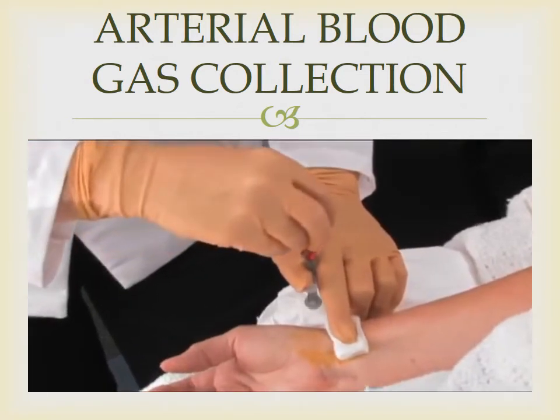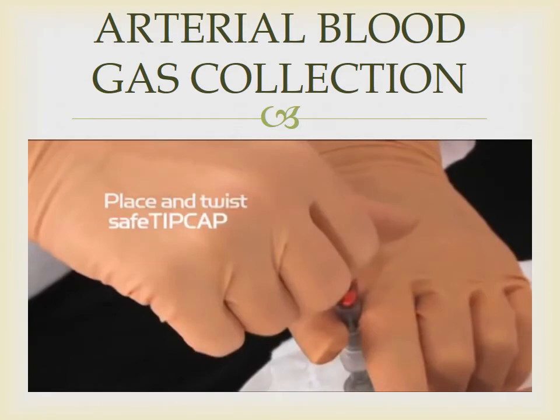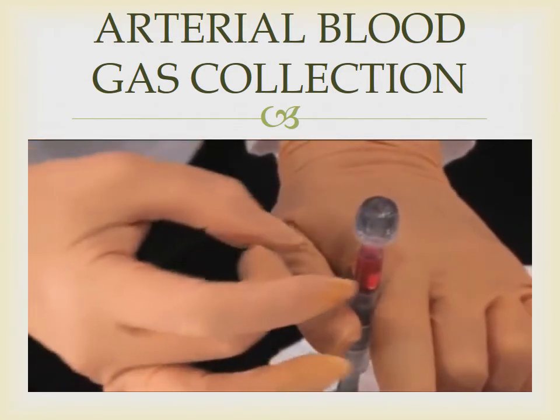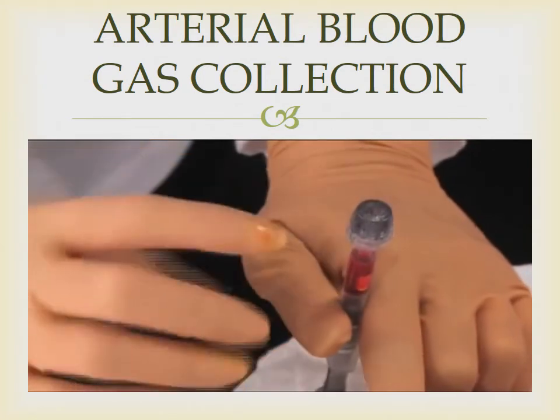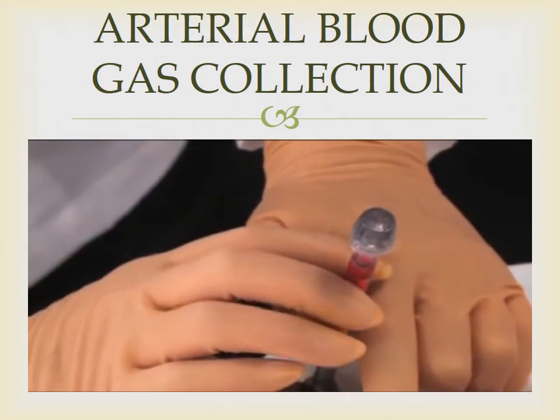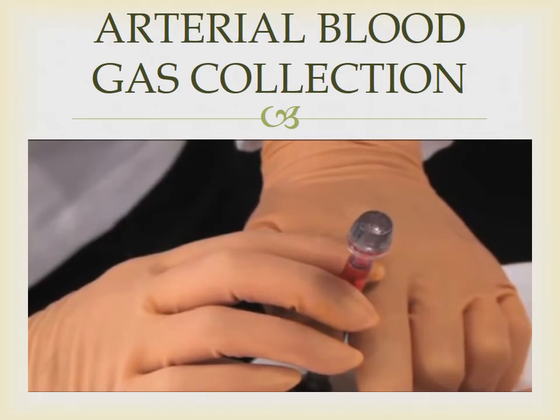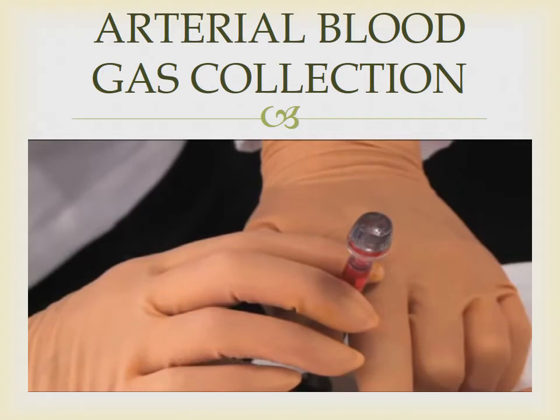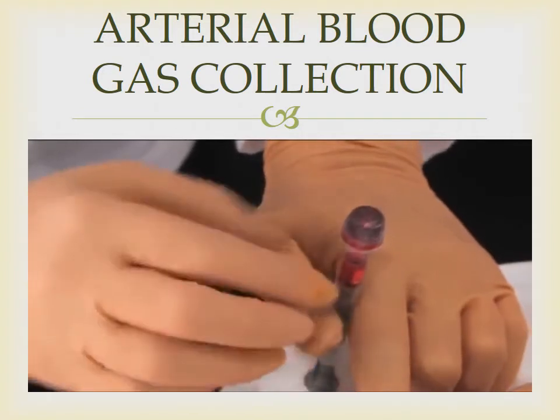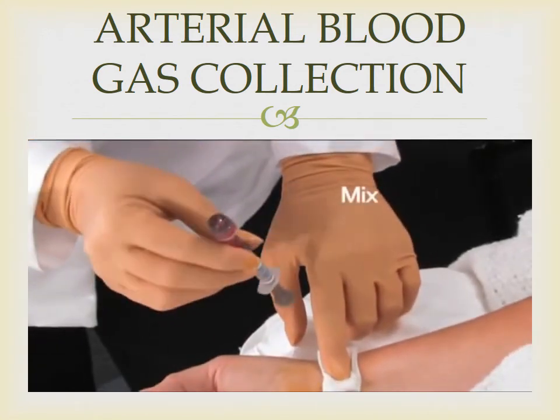Firmly place and twist the safe tip cap a quarter turn onto the syringe. Hold the syringe vertically so the safe tip cap is at the top. Gently flick the syringe barrel so that any air bubbles will rise to the top. Press the plunger slowly to expel the air through the vented safe tip cap. You will see a red band form in the tip cap and feel resistance in the plunger, indicating the air has been removed and you now have a sealed anaerobic sample. The sample is now ready to be mixed.